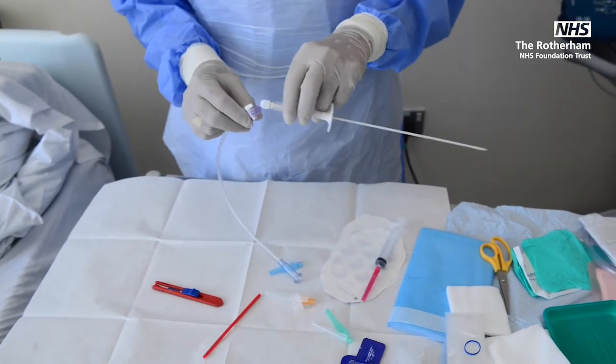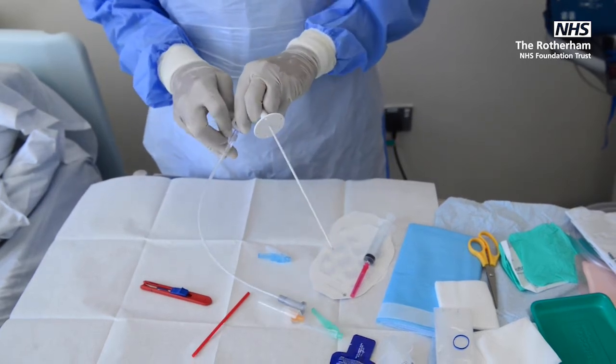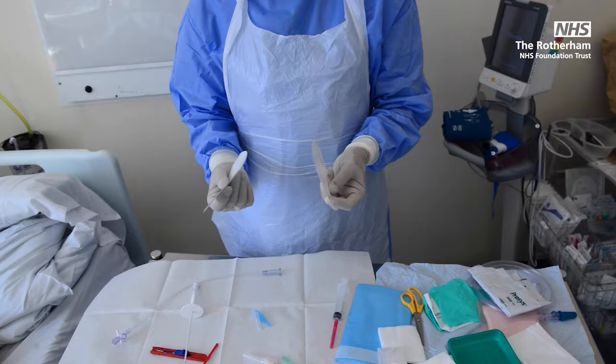It's a 3-way. It has got a 2-way tap. So it connects there. Make sure that it is locked. Otherwise, you might drown yourself with the ascitic fluid that comes out. Then 2 latex-free dressings, like the Tegaderm.